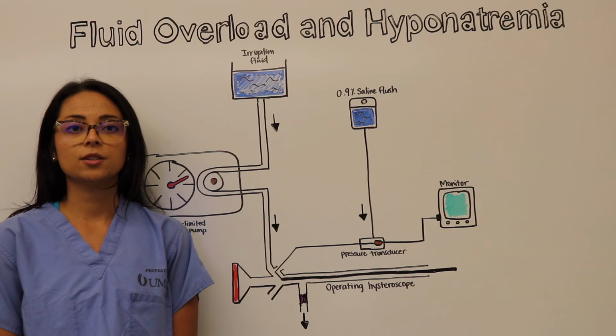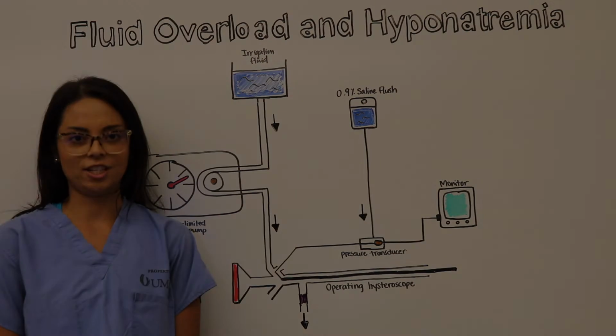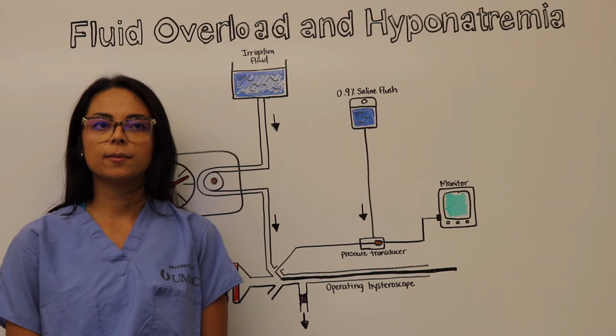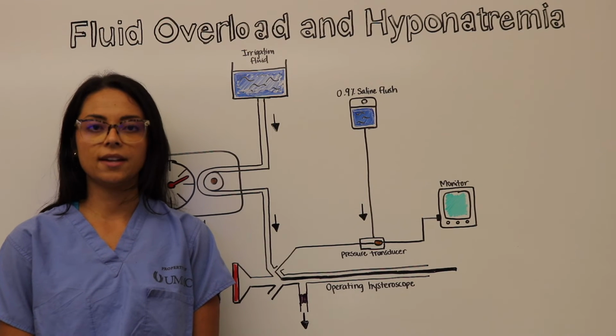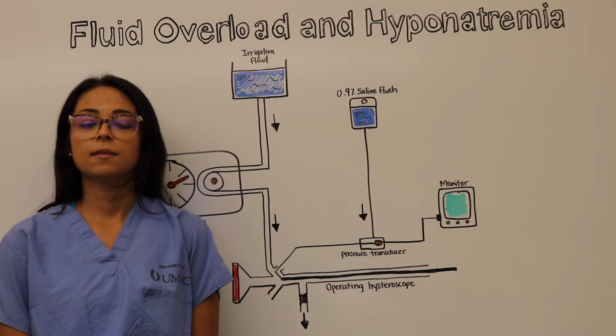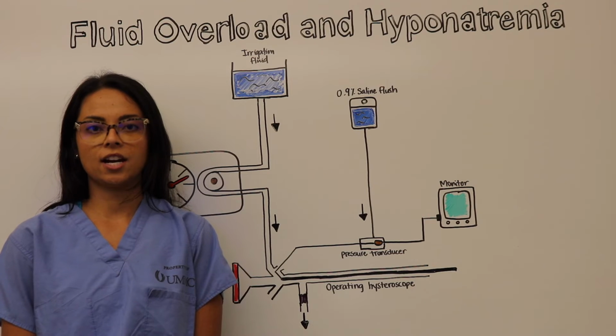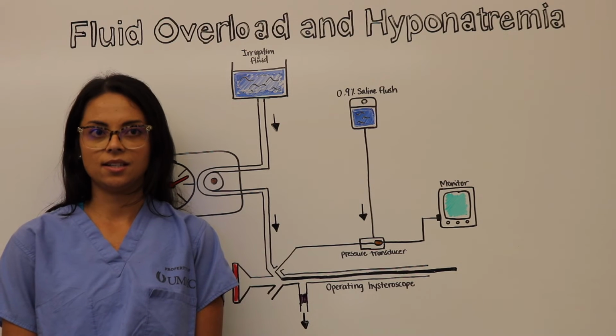It is recommended to include anesthesia in the discussion of stopping further fluids and concluding the procedure. If fluid overload and hyponatremia does occur, terminate the procedure, assess hemodynamic, neurologic, respiratory, and cardiovascular status, measure serum electrolytes and osmolality, and administer an intravenous diuretic, such as furosemide if needed.